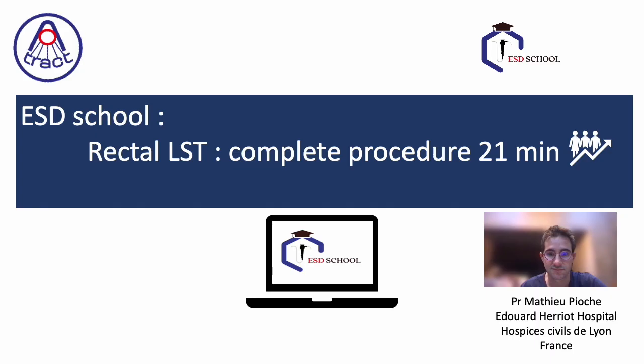Enjoy the video. Hi everybody, we are here for one of the new parts of the ESD School, which is the complete procedure. In this case, we will see only the endoscopic view of the procedure, which was a rectal LST ESD lasting 21 minutes, and I will try to comment on all the things.